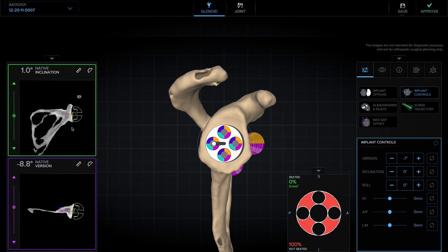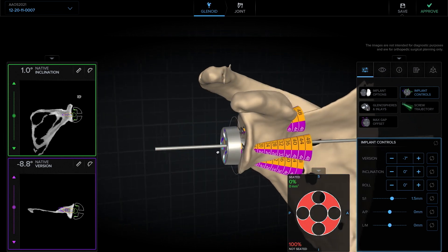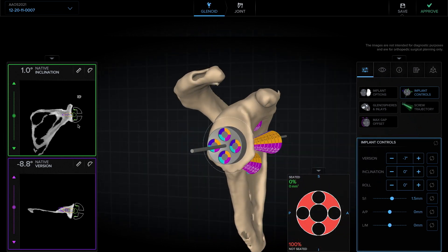Then we'll typically look at the coronal plane. I like the glenosphere to be flush or a millimeter inferior, and that can be adjusted on the coronal plane. I can also look at the 3D to confirm this. If we look at this position, we can see the line shows that we're flush or just inferior and the glenosphere is sitting flush or just inferior. On this axial view, I can also adjust the anterior or posterior position of the base plate. I typically like to center it as best I can, and this seems pretty well centered.